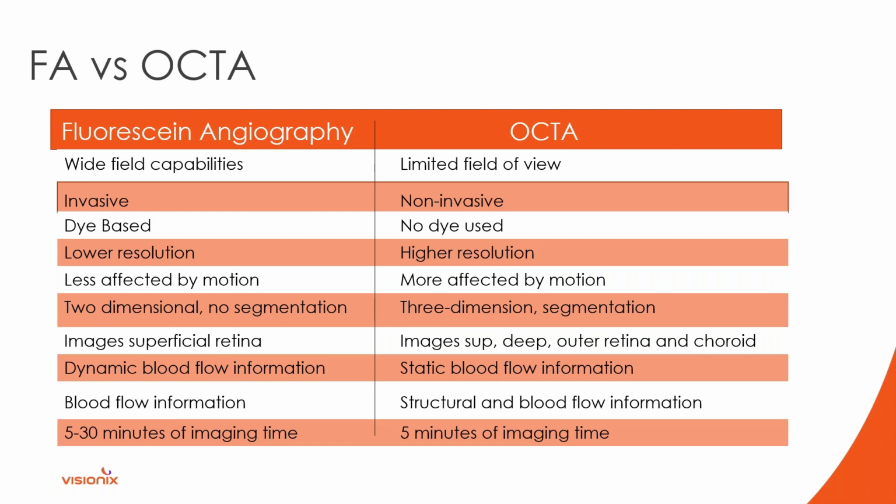OCTA is very affected by movement because, remember, I told you that this technology is based on the movement of red blood cells within the eye. So any time the patient moves, the machine might think that that's actually a red blood cell moving. A patient who has difficulty sitting still is not the best candidate for OCTA.